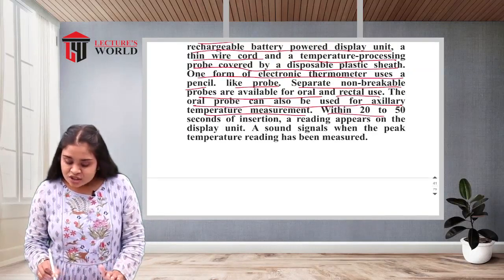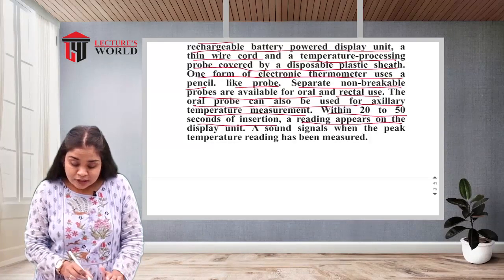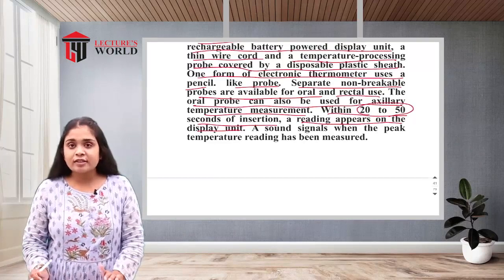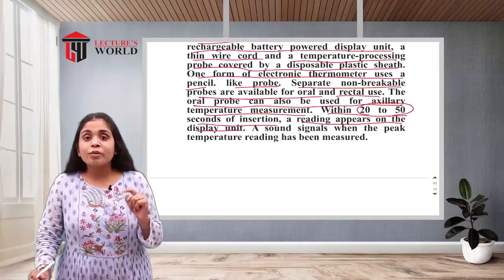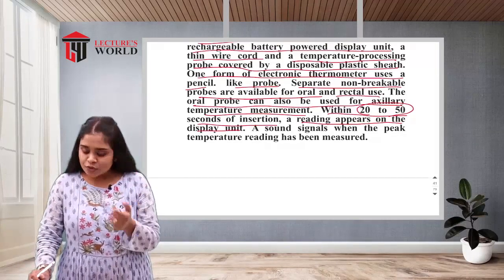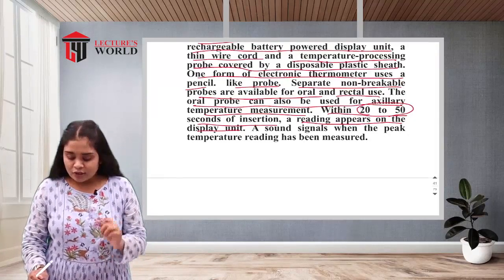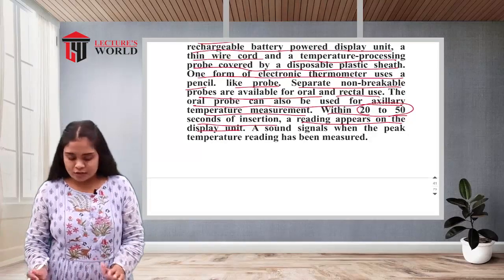Then within 20 to 50 seconds of the insertion, a reading appears on the display unit. So it takes only about 20 to 50 seconds. When compared to the glass thermometer, which takes time to do the processing, this is the advantage of this digital thermometer. So it takes only 20 to 50 seconds to know the temperature of the patient.